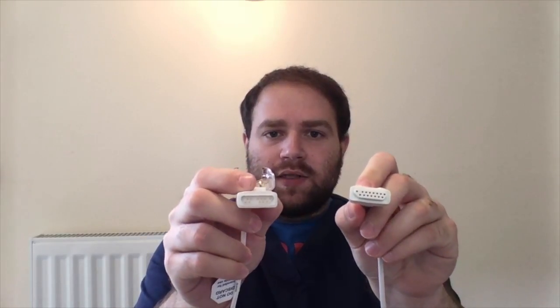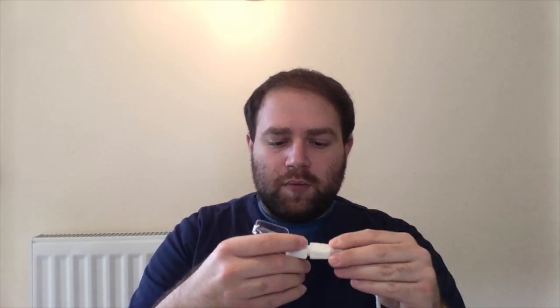This device can be used with all the probes that have an MLNCS connector. The probes are very easy to change, so if you break one or you just want to use a different one, you can easily and quickly do it.